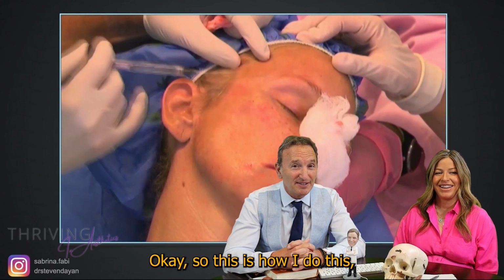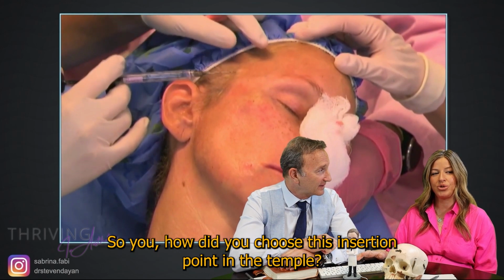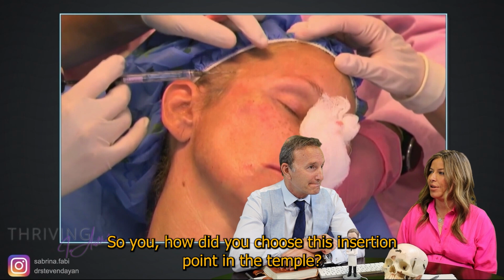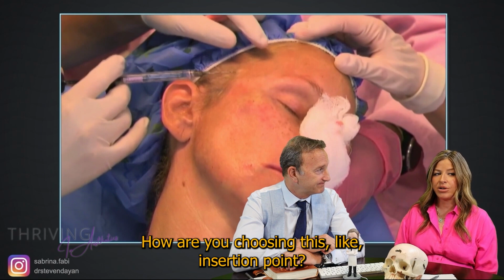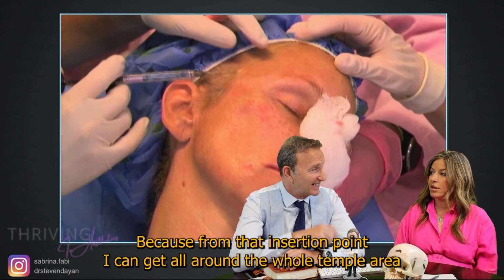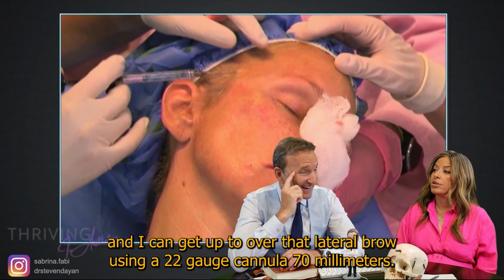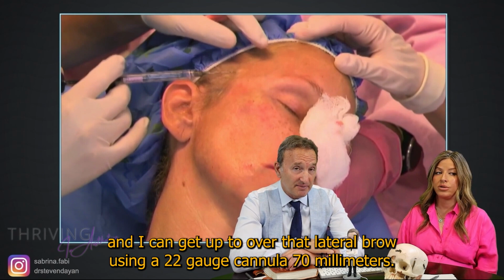Okay, so this is how I do the temple area. I want to pause here real quick. So how did you choose this insertion point in the temple? You're treating the anterior temporal fossa, so that's important. How are you choosing this insertion point? Because from that insertion point, I can get all around the whole temple area, and I can get up over the lateral brow using a 22 gauge cannula, 70 millimeters.